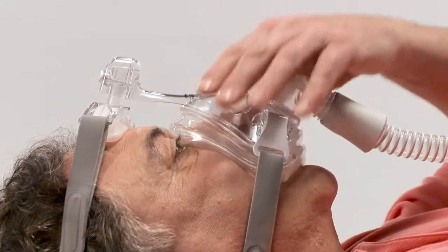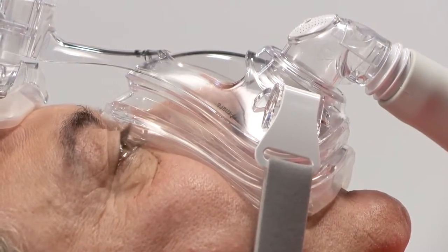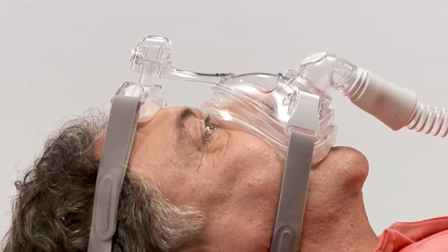First, reseat the mask by pulling it directly away from the face and gently setting it back into place. This allows the cushion to create a new seal.